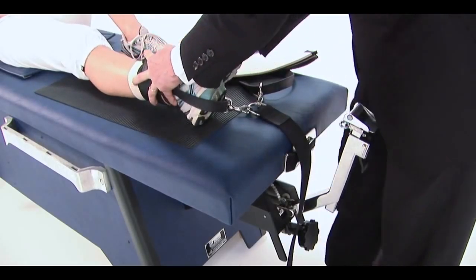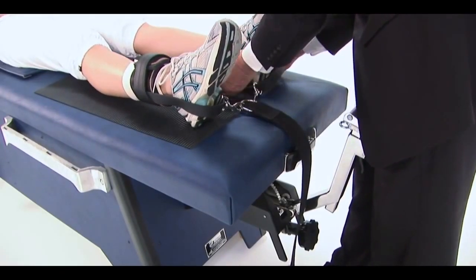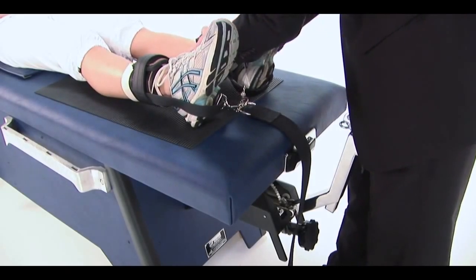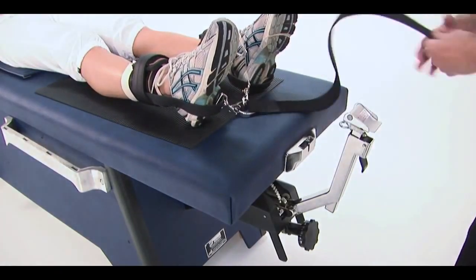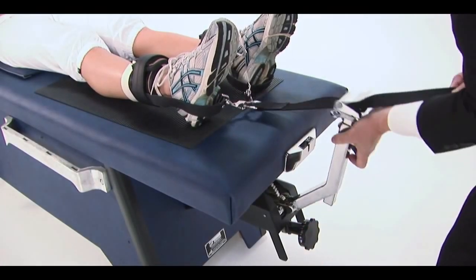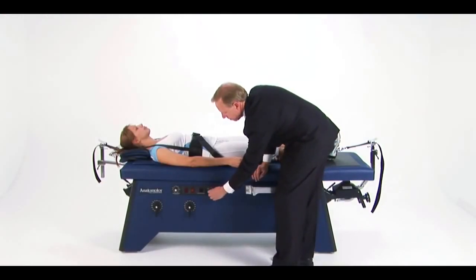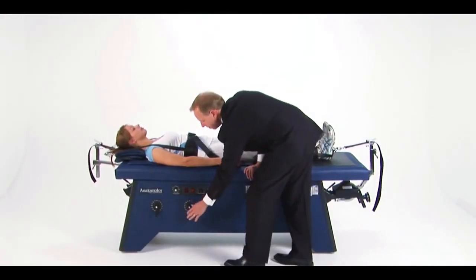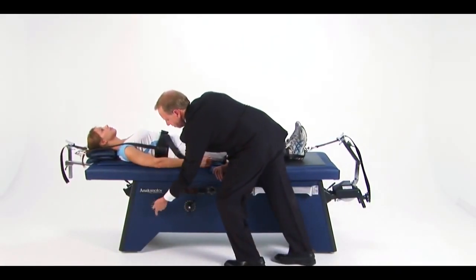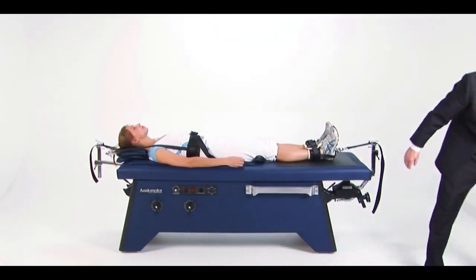With it, the forces of traction can be applied throughout the hip and lumbar area, or they can be isolated to one leg. This can be very effective when treating a patient with sciatica. Feed the web strap through the buckle and push the traction arm towards the table. Treatment time is usually set for 7 to 10 minutes. Now, if not contraindicated, the back rollers should be set. Place the insert block beneath the patient's knees. This will help transfer the traction force to the hip and lumbar area.